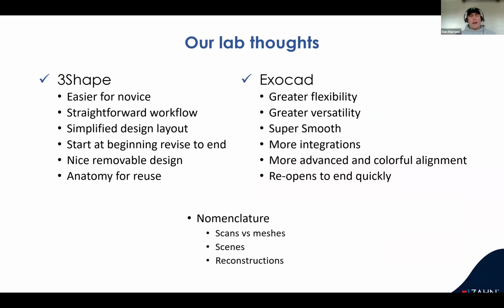I wanted to mention our thoughts in the lab on 3Shape and exocad. And this is just our lab. Other people might think the opposite, but we generally think 3Shape is easier to navigate and get through, but exocad has that greater flexibility and versatility. And that is what drew me to it. I got tired of getting stuck in it. I really like having two options for anything so that you can always get through it. And we'll go through some of that.